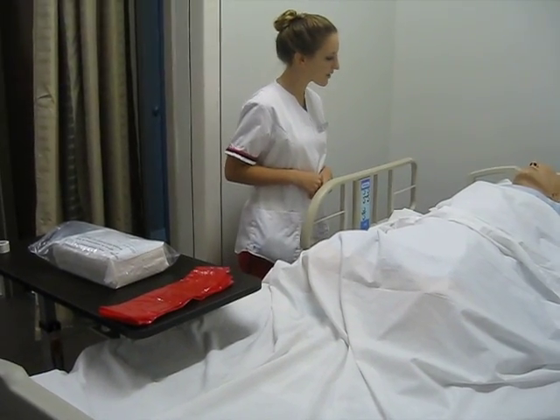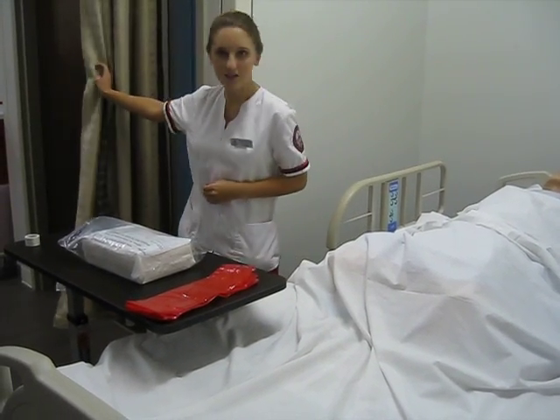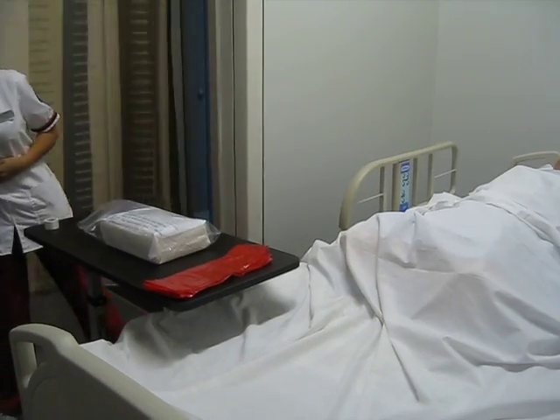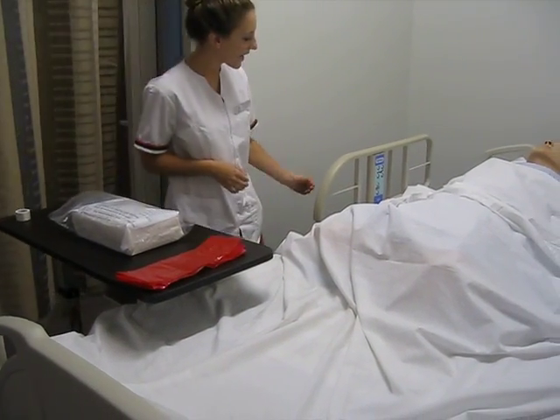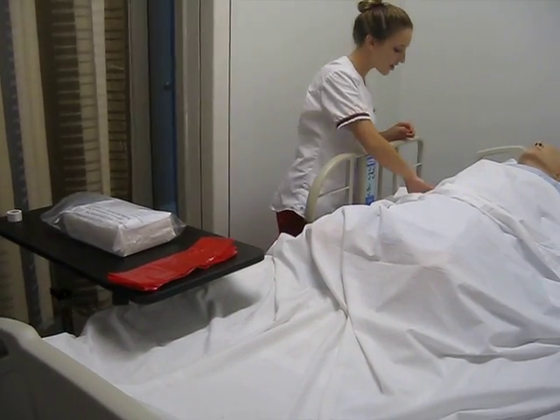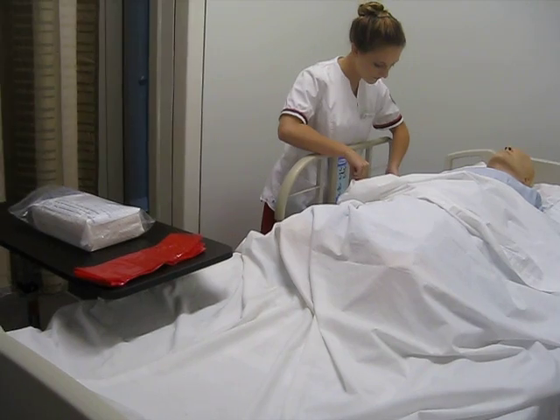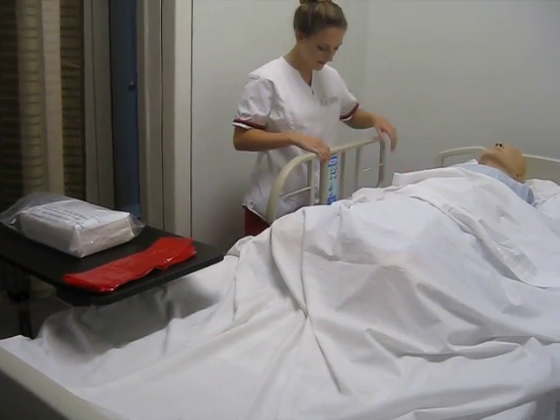Before we get started, I'm going to go ahead and close the curtains to ensure your privacy. Can I have you confirm your name and date of birth for me? Thank you, Amy.